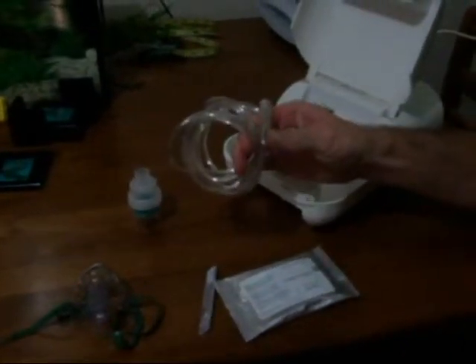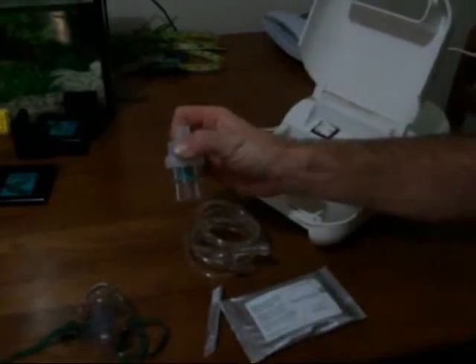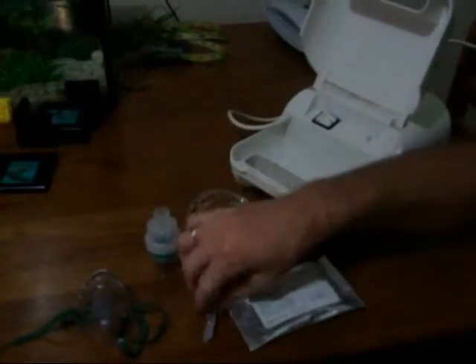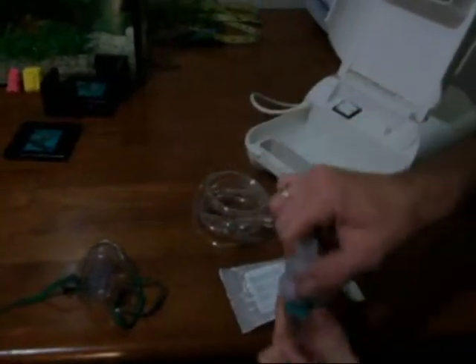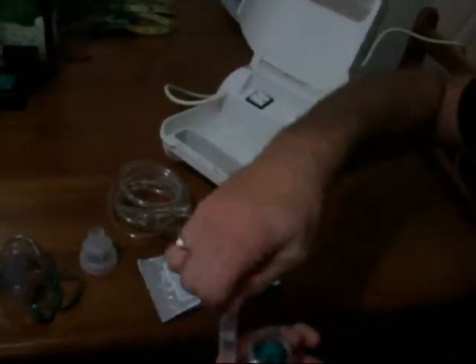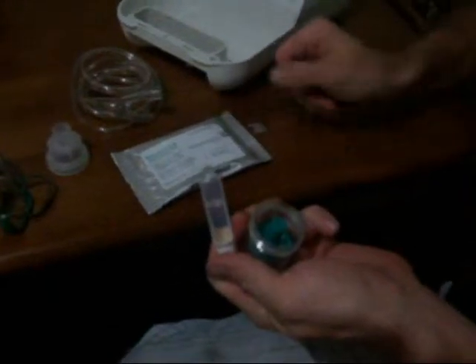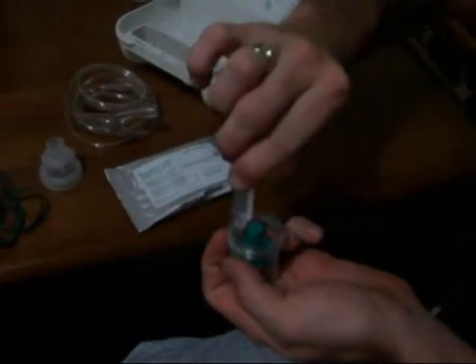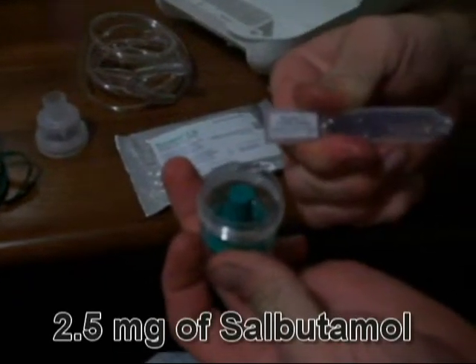A fresh hose, the canister that the formula will go in, and the medicine itself. Removing the cap from the canister and breaking the seal on the medicine. Ensure that the seal is good before it is opened. And ensure that you have given the correct dosage.